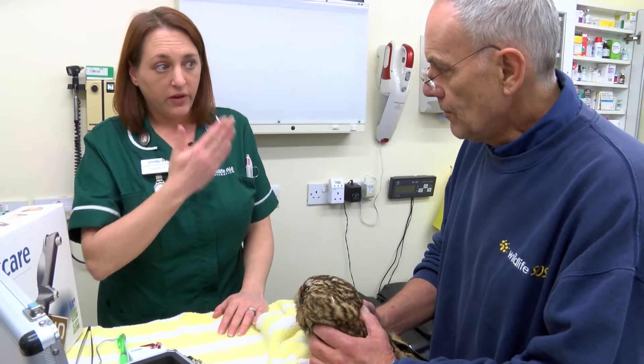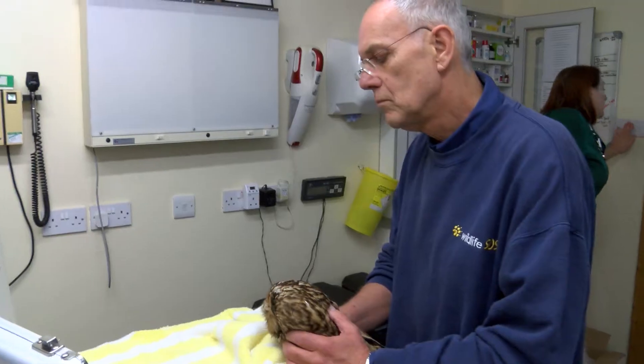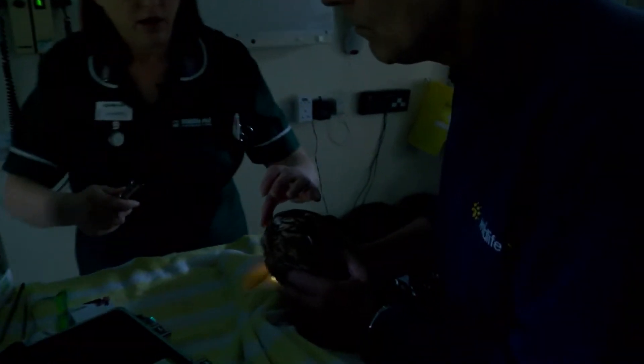We're just going to have a quick look in the eye and see what's happening with the hemorrhage. I'll just turn the lights off. So I'm just going to have a quick look in the eye and there's a good start.